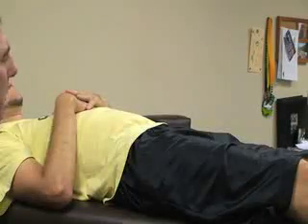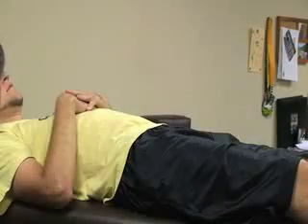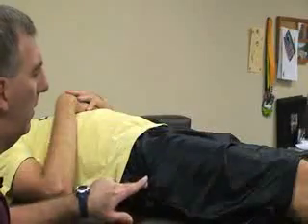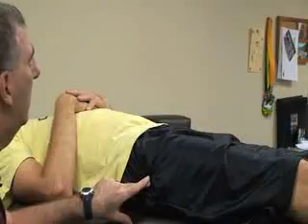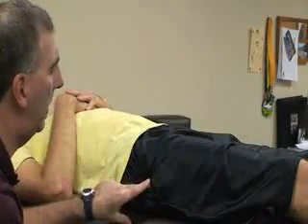The first goniometry measurement for the hip is going to be for flexion. Normal flexion is 120 degrees. Our fulcrum is going to be on the greater trochanter on the lateral side of the hip. I'm going to have the patient in a supine position with his leg extended and his knee extended, and as close to the edge of the table as possible.